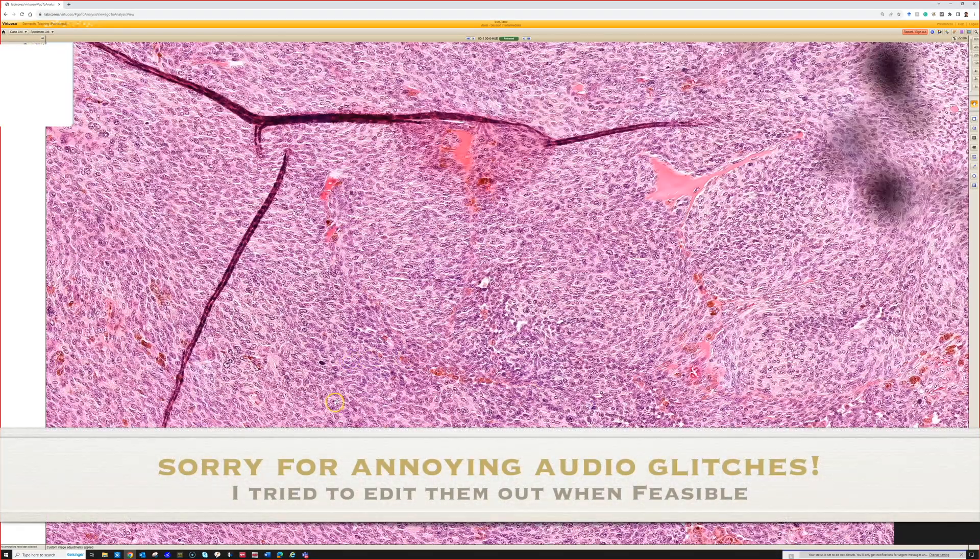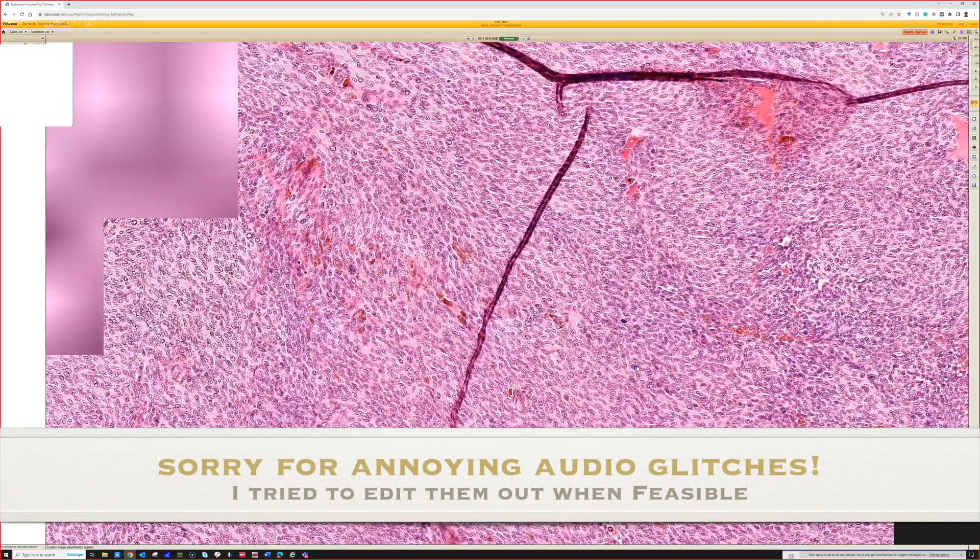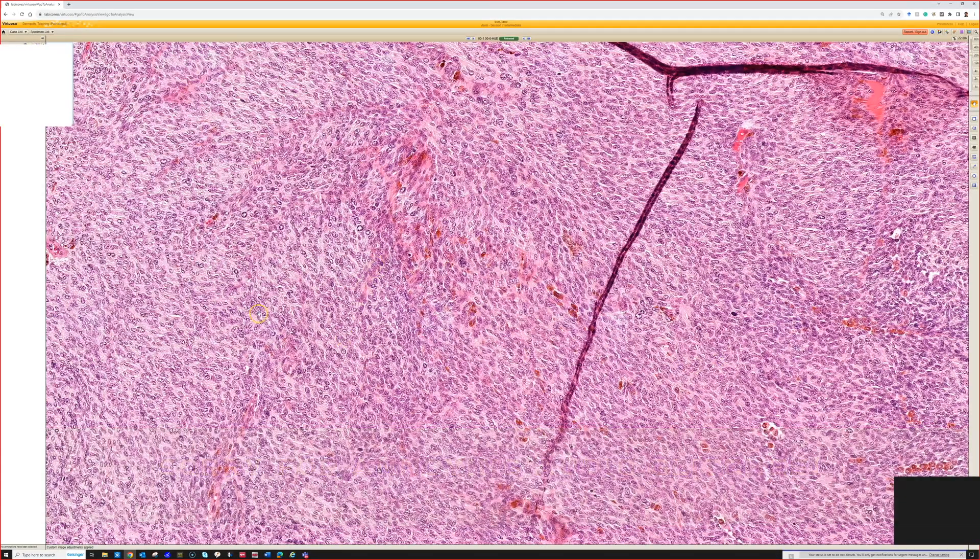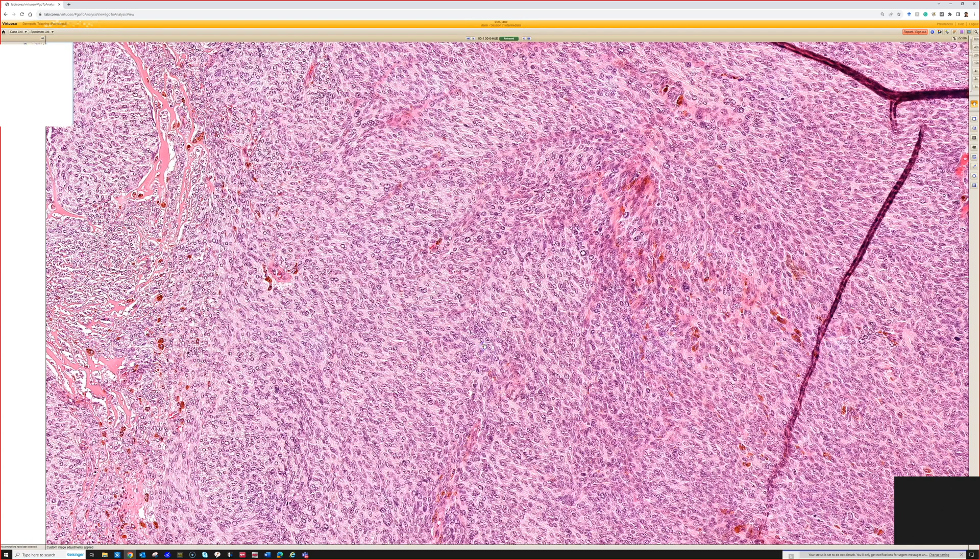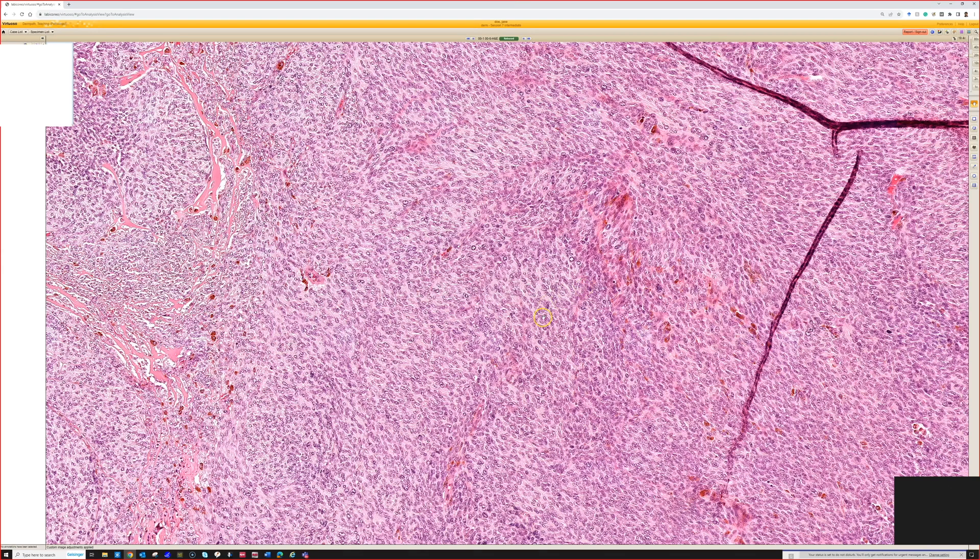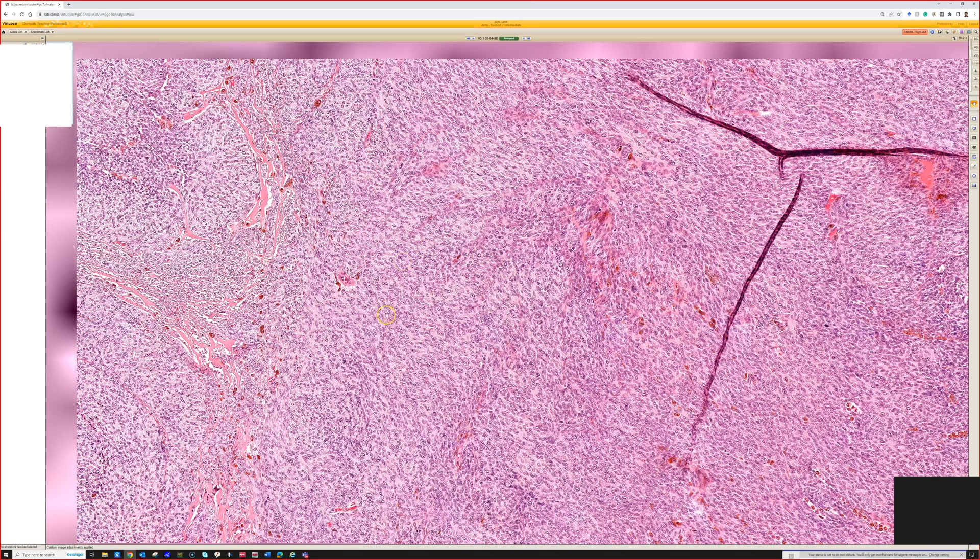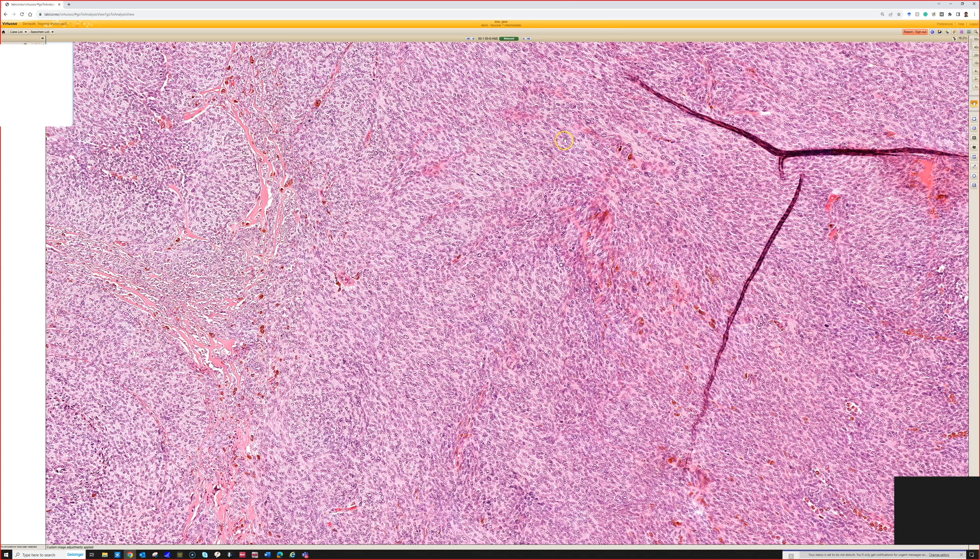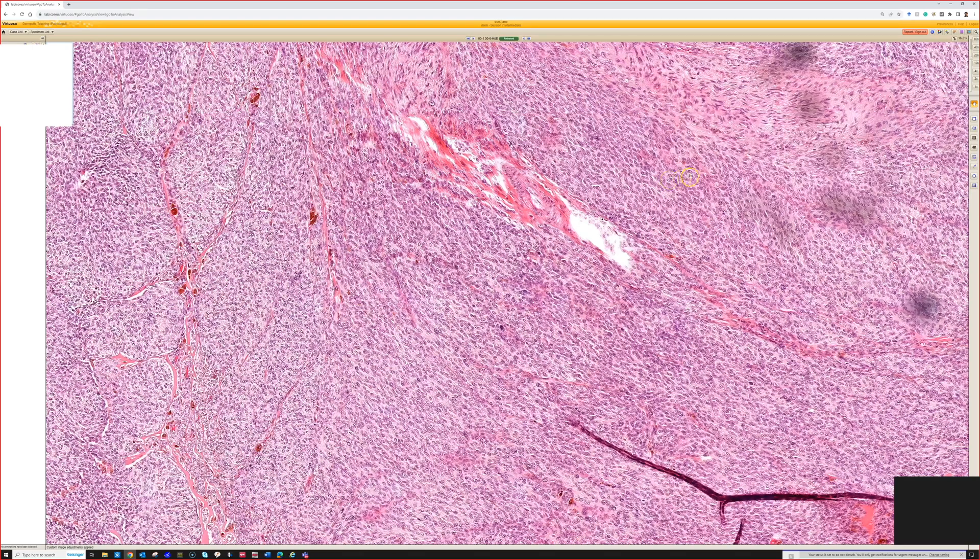You can see some mitoses. If you start seeing a lot of mitoses or atypical mitotic figures, that would also be a time to seek expert consultation. There is such a thing as an atypical cellular blue nevus, which has an overlap with melanoma and is very challenging. That's beyond the scope of this lecture and I still find it very complicated in practice.